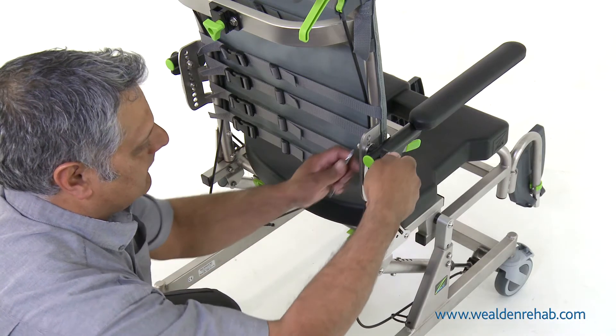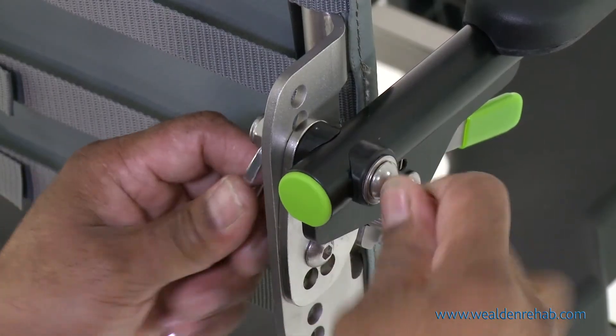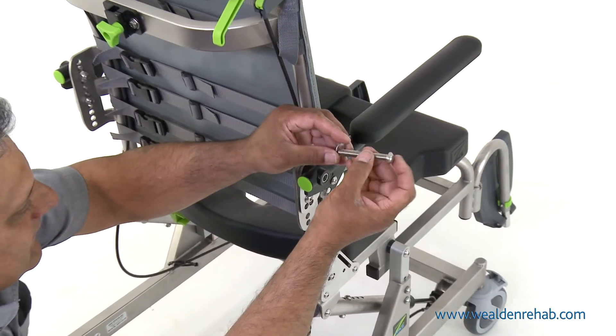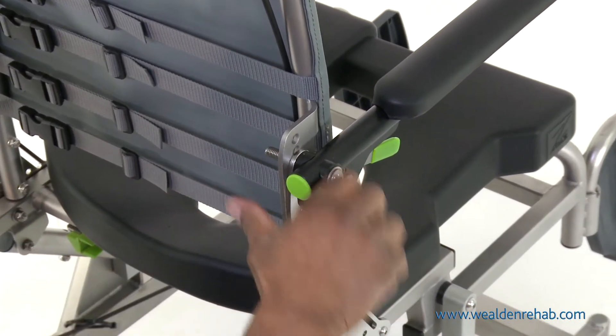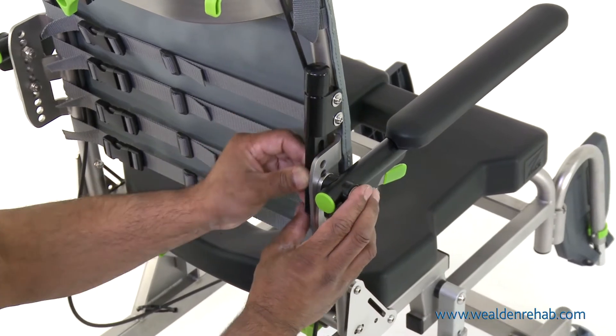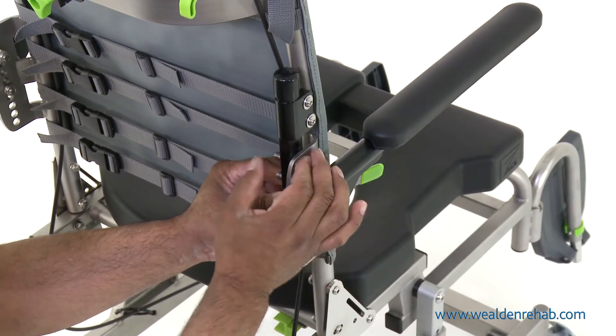First, remove the main armrest bolt and replace it with the longer bolt and washer supplied. Place the lateral support rod mechanism over the longer bolt and insert the shorter bolt into the highest position.